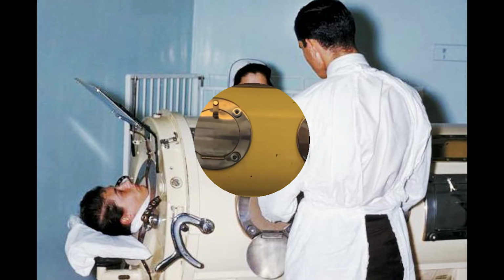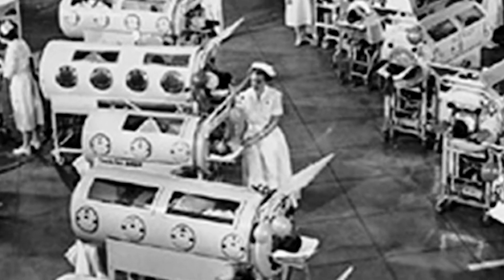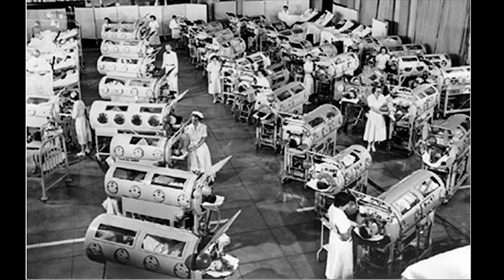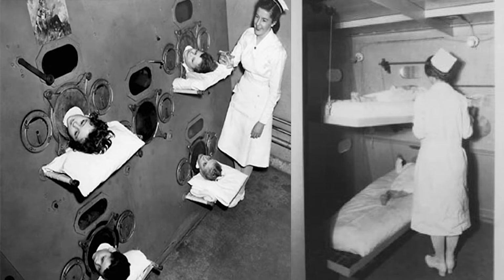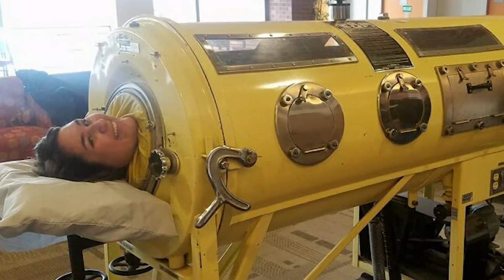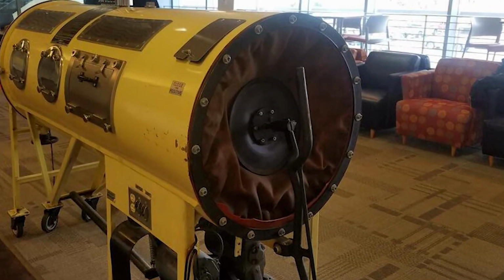Negative pressure ventilation really became popular during the polio epidemic that occurred from the 1930s to the 1960s. Patients suffering from poliomyelitis with worsening respiratory failure were placed into the iron lung to provide ventilatory support until the time when they could support their own ventilatory demands. The use of negative pressure ventilation was the first form of consistent artificial ventilation.